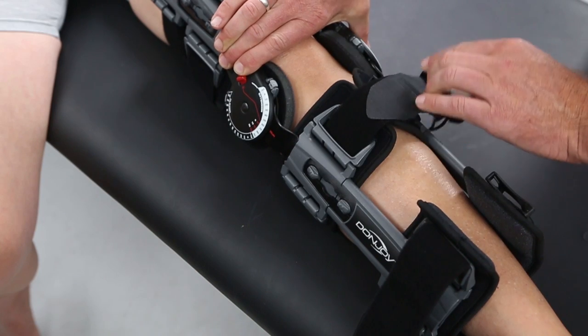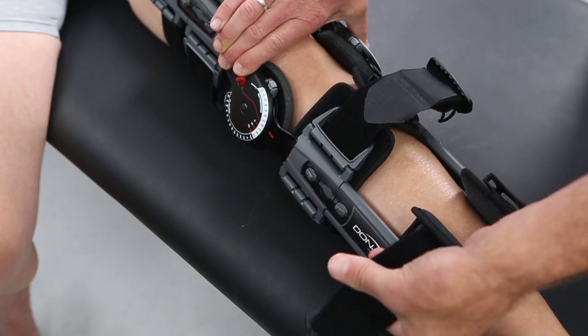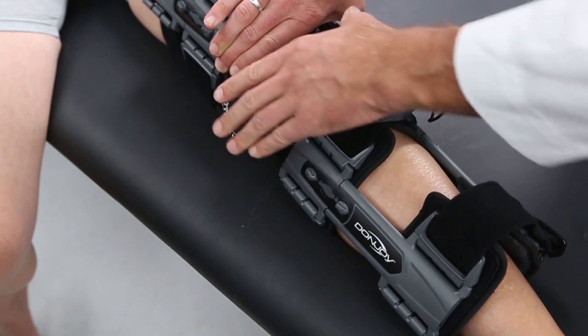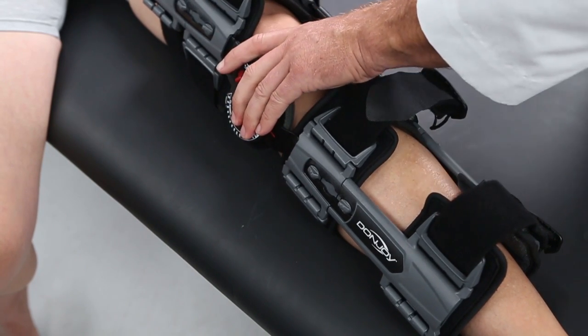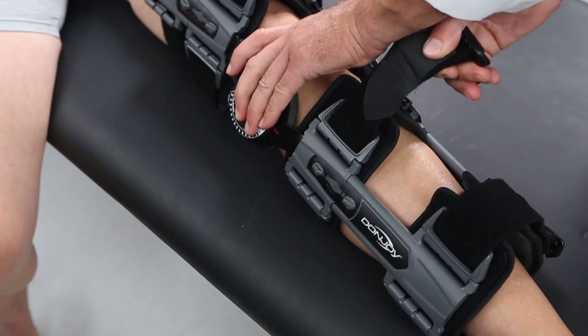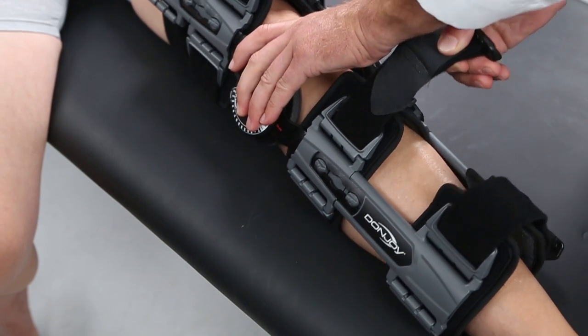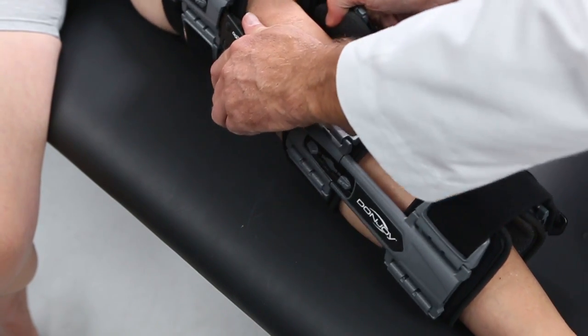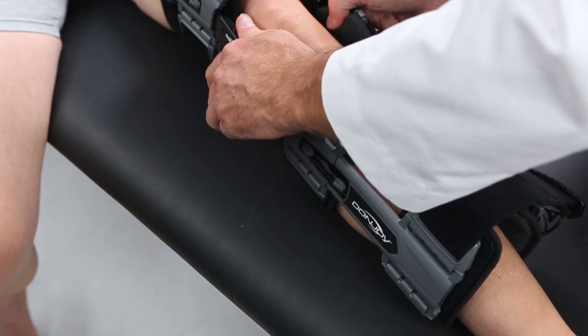Remove the strap from the Velcro retainer and, by pulling away from the body, remove slack from the back of the brace. Reattach the strap to the Velcro to ensure posterior strap length remains the same. Check to make sure the uprights are aligned on both the medial and lateral sides of the patient's leg.